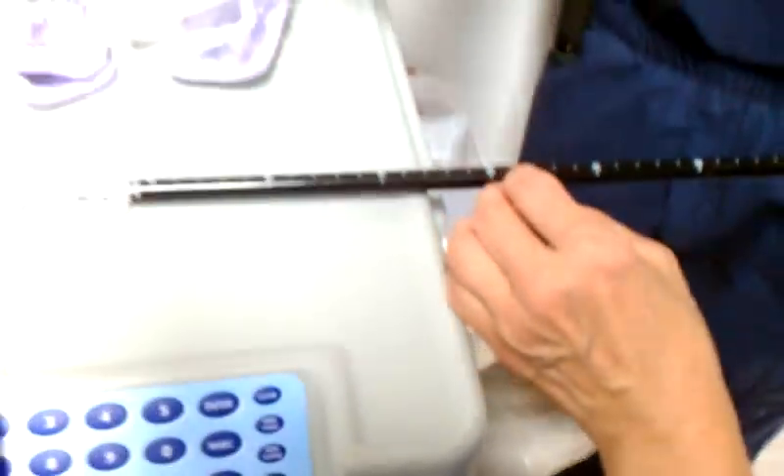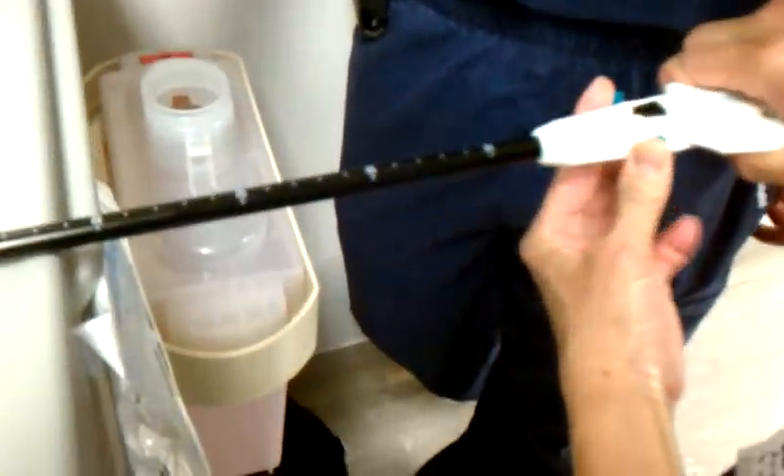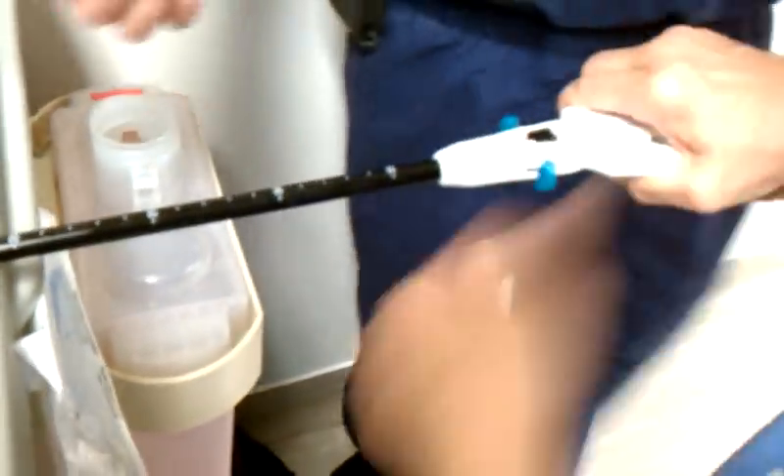Now you've got to lock that needle in. So pull these two. Push them towards you. That's it. It's a click. It's a click.